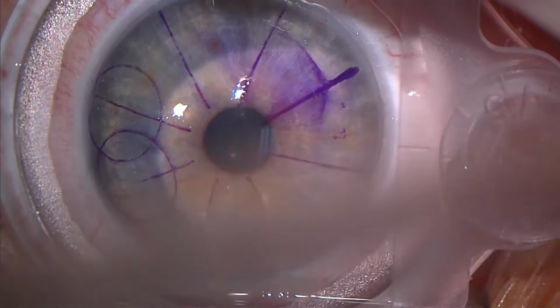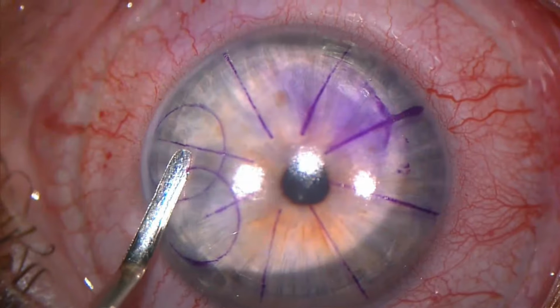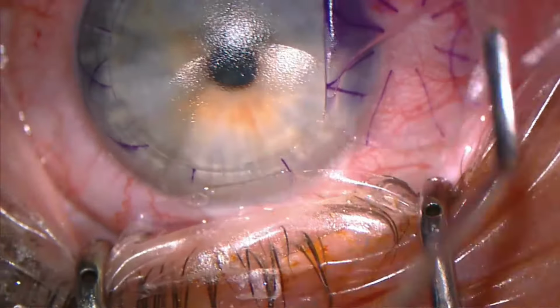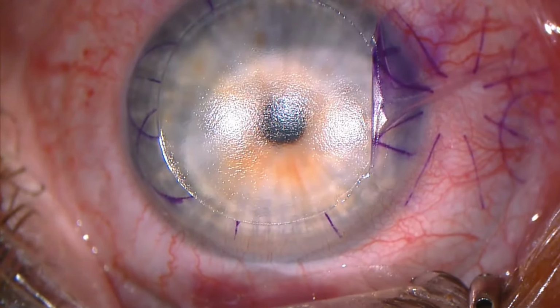Note the microkeratome's dial. This is set based on Moria's nomogram, which includes K readings and the desired hinge chord length. Again, the flap is atraumatically lifted, and the nearly perfect stromal surface is exposed. No drying is necessary. The laser is applied, and the flap put back into position.